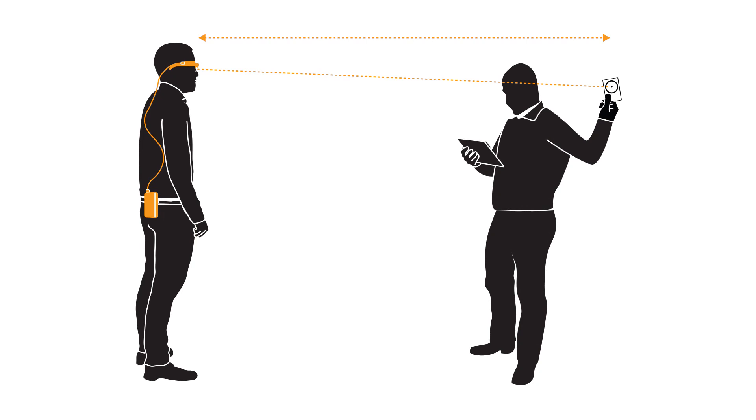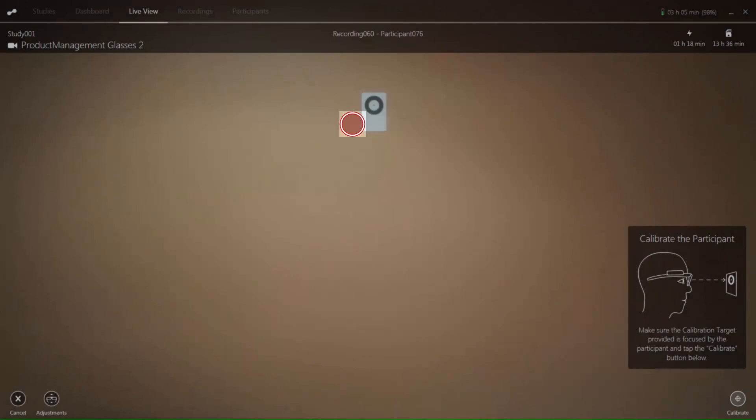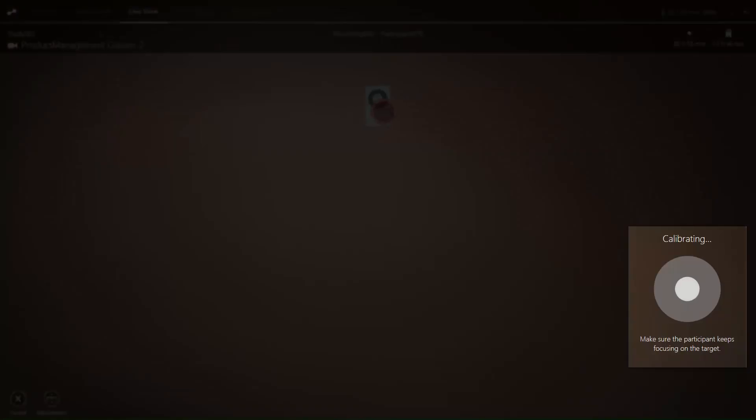You need a calibration card or sticker for your participant to view. Please ensure that the participant is placed an appropriate distance from the calibration card. Instruct the participant to look at the centre point of the calibration card and then make sure you're getting gaze data, indicated by the red circle. If you are not getting gaze data, adjust the head unit on the participant's head or change the nose pad. If you are getting gaze data, instruct the participant to continue looking at the centre point until you tell them otherwise. If both of these are true, click the calibrate button.